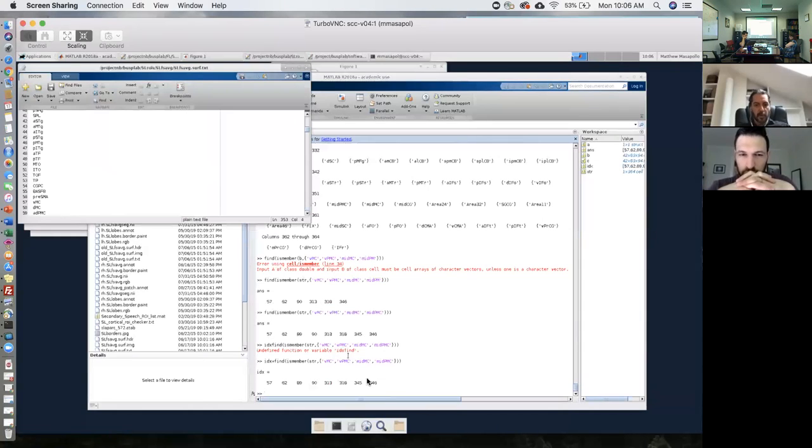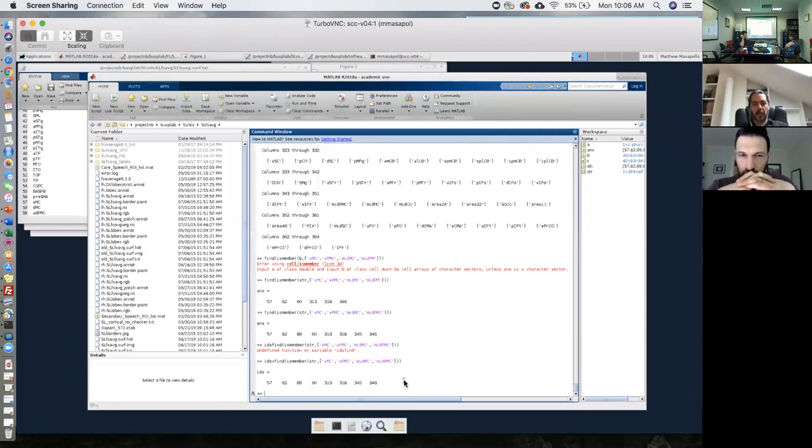Ventral motor cortex. Okay, perfect. So these 8 numbers are the ones that we want to combine, and they are sorted by left and right. Do you want to have them as a single file that contains both hemispheres, or as two different ROIs? So you want to analyze the left and right of these regions, right?